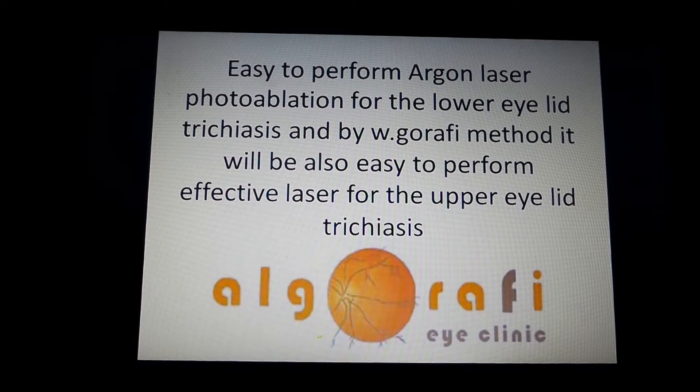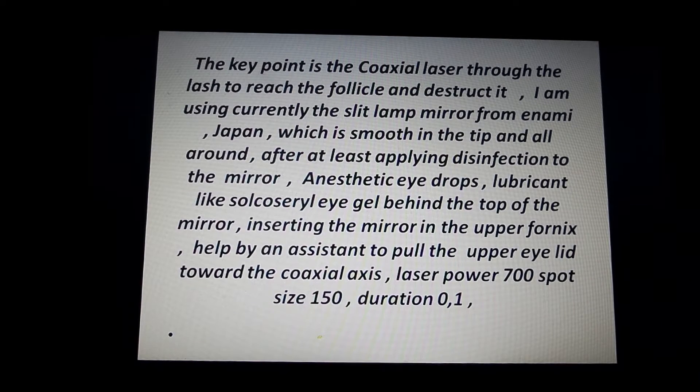Argon laser photoablation for lower eyelid trichiasis is easy to perform, and with the W-Girafi method, it will also be easy to perform effective laser treatment for upper eyelid trichiasis. The key point is the coaxial laser through the lash to reach the follicle and destroy it.